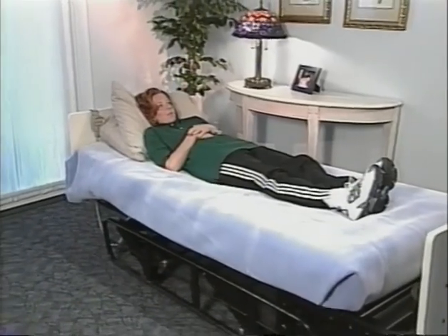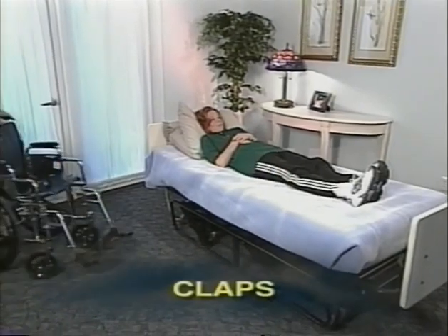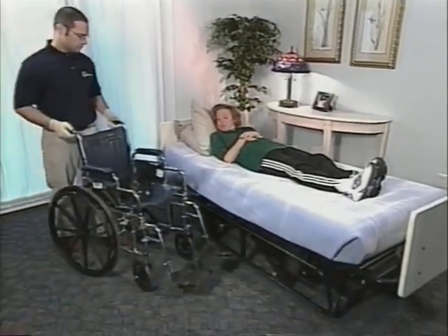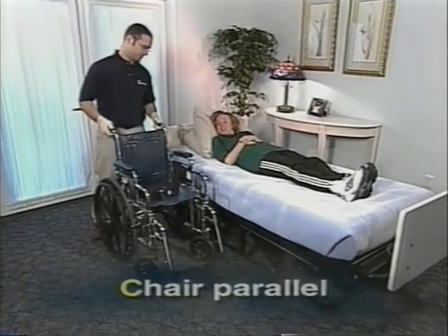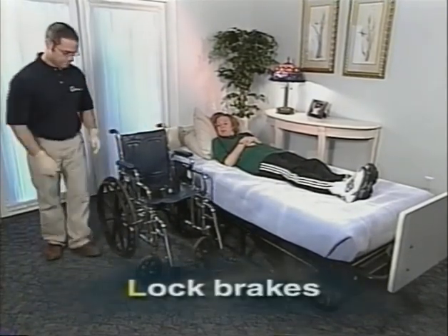The first part of a transfer includes wheelchair preparation. Use the acronym CLAPS to remember what is needed. Chair is positioned parallel or at a slight angle to the surface you are moving from. Lock brakes.